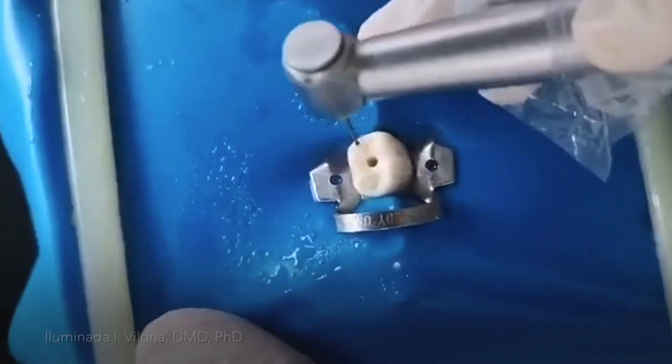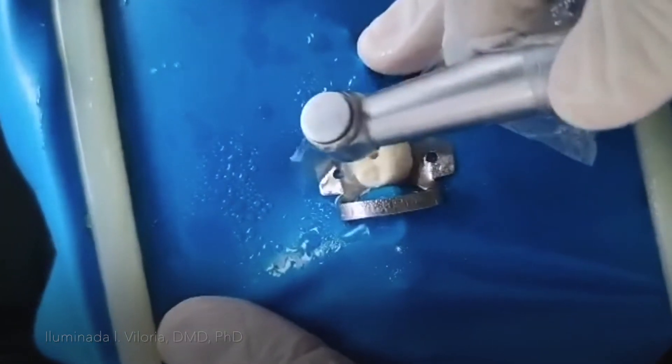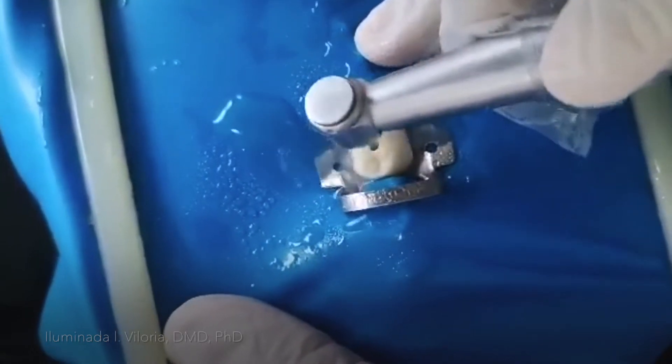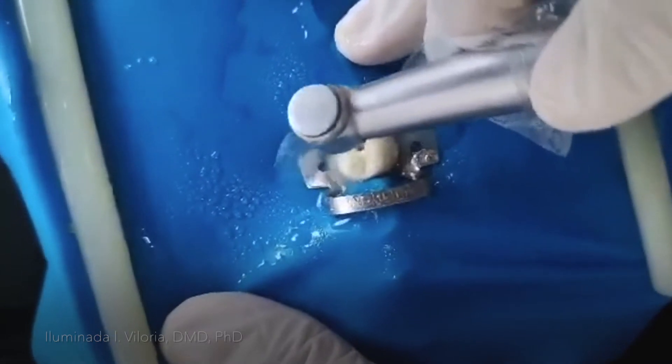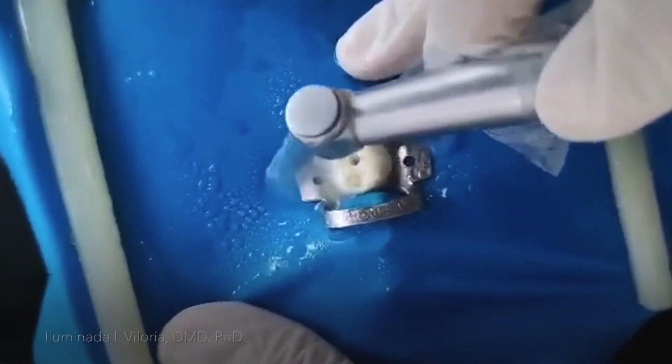I'll start drilling again. That's the drop-in. Now I move towards the mesial, also towards the mesiobuccal, buccal, and lingual. This is how you unroof it.